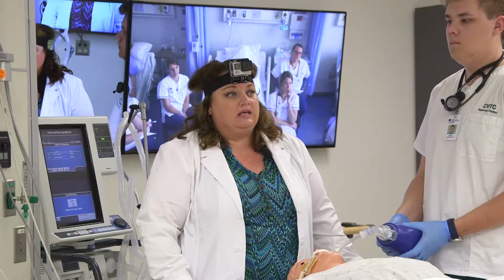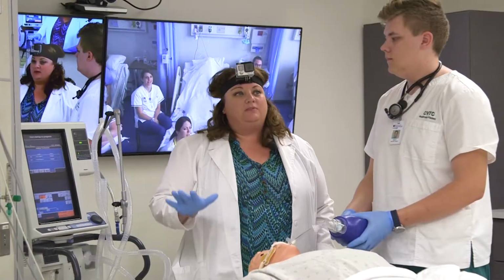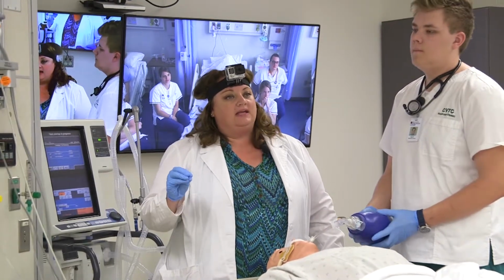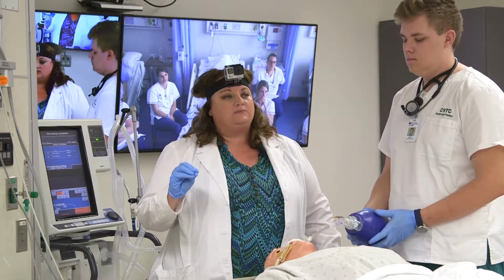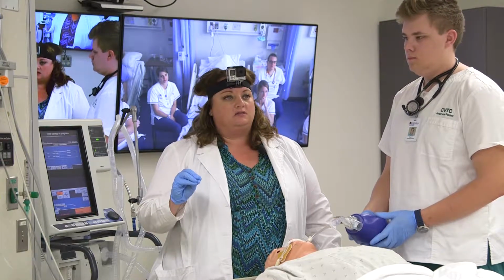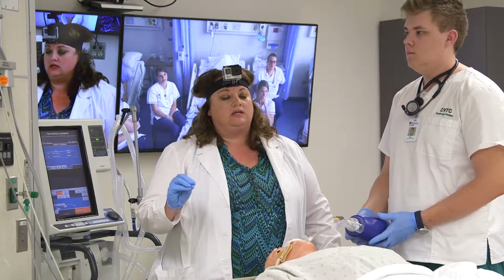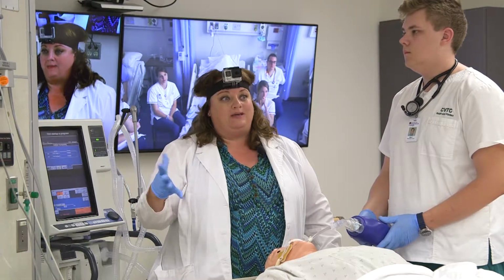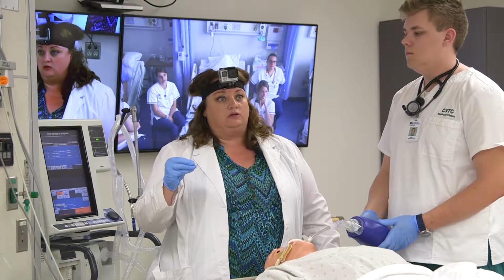So if he's 80 kilos and I want to do 7 milliliters, what do we got for a tidal volume? 560. Thank you. So I'm going to put him on 560, and that's right in the middle range for what he should be at. We want to keep in mind that he is an asthmatic, and because he's in severe status asthmaticus, he's probably going to have a lot of trapped air in his lungs. So I may even want to go a little bit lower than that once I get him on the ventilator to make sure that he is adequately being able to ventilate without popping his lungs, because we could easily blow a pneumo and give him some barotrauma with any type of volume we try to push into him.